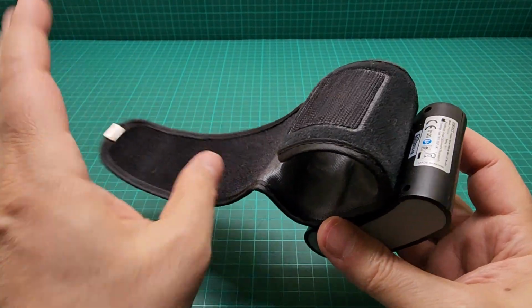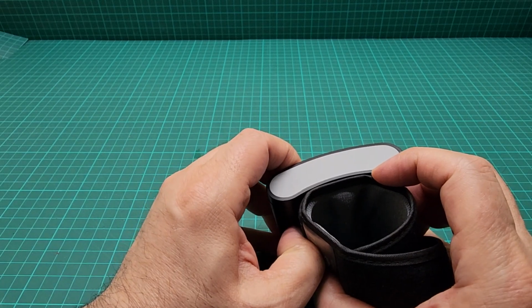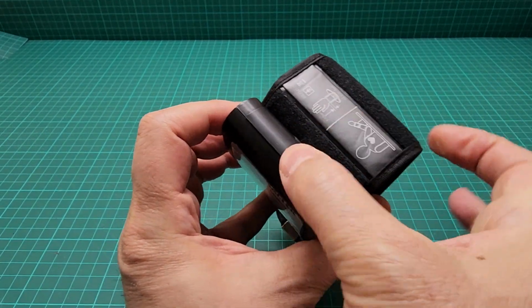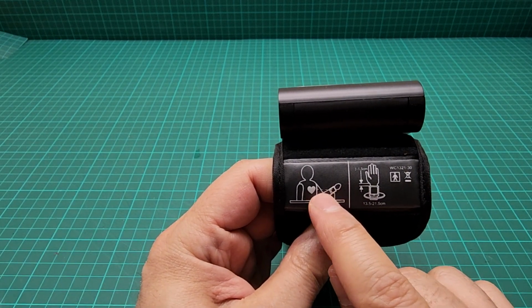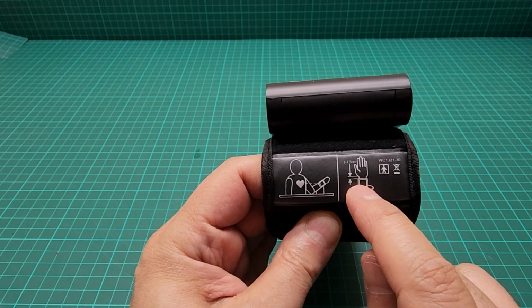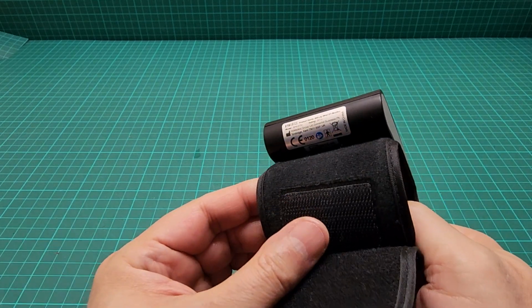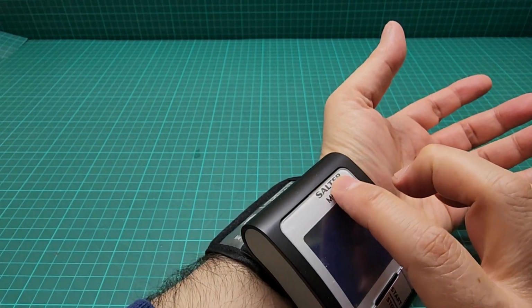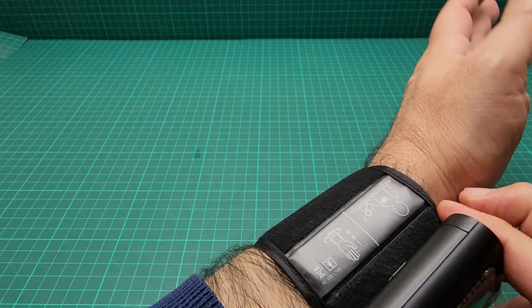It has a battery compartment here. Let me see, it's here, and when you open it, it is not very easy. You face two AAA batteries. That is good. And then here it shows you the level of your arm against your heart, and how you are going to place it on your wrist. This is very handy if you don't know how to use it. It has a velcro at the back, and when you use this, the item has to be facing you to avoid reading upside down, and then place it 1 or 2 centimeters above your hand.